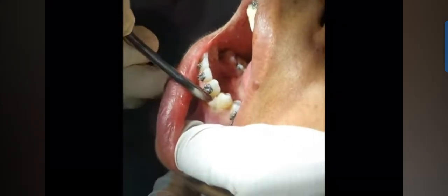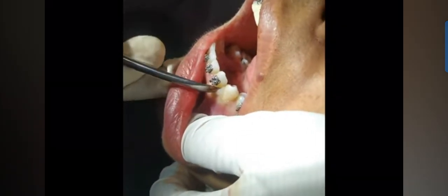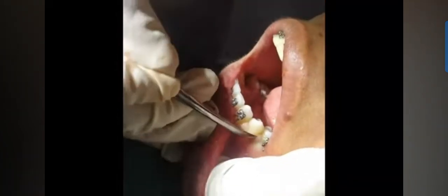You can see I'm holding a periosteal and I'm retracting the papillary region between the premolar and the canine. This papilla should not be torn, otherwise it will cause sensitivity to the patient and towards the other premolar. And I'm going to expose the tooth in order for the root to be visible, just like the same procedure we have in the maxillary premolar.